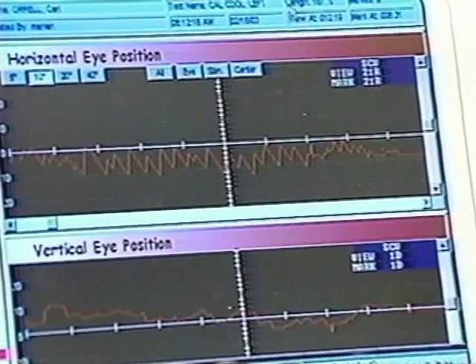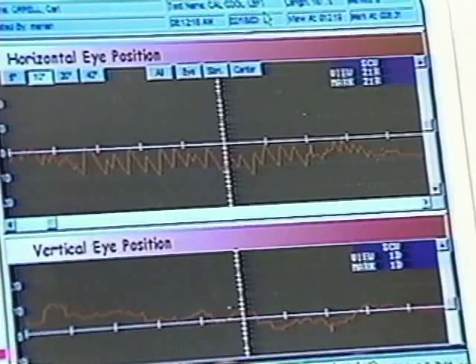This demonstrates stimulation of the left ear with the cool caloric testing modality. There is again noted brisk sawtooth nystagmus of 21 beats to the right, which is the expected direction of the fast phase of nystagmus with caloric cool left testing.